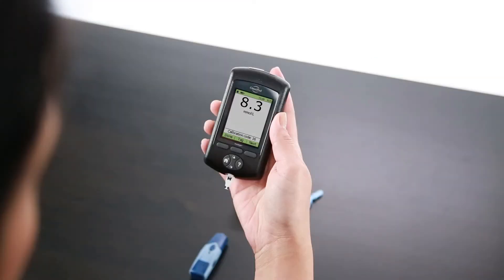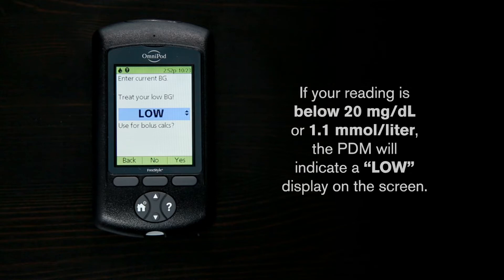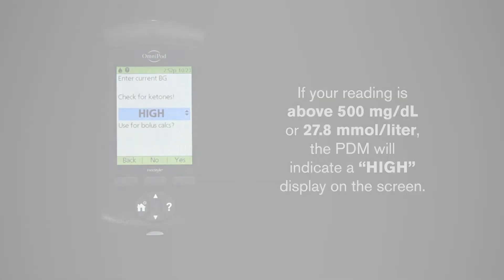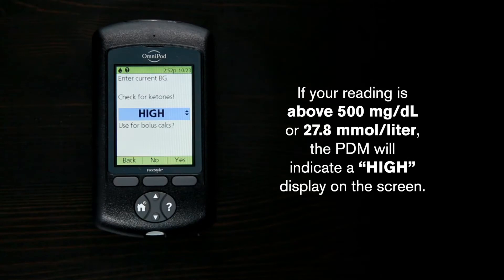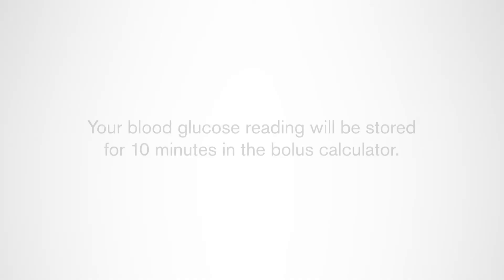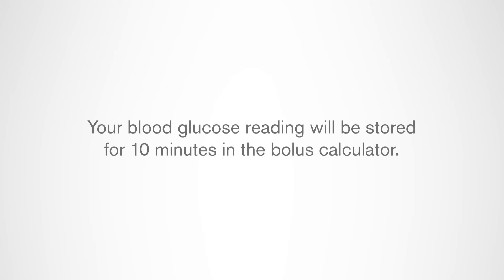If the suggested bolus calculator feature is turned on, when you check your blood glucose the PDM will display the result. If your reading is below 20 milligrams per deciliter or 1.1 millimoles per liter, the PDM will indicate a low display on the screen. If your reading is above 500 milligrams per deciliter or 27.8 millimoles per liter, the PDM will indicate a high display on the screen.